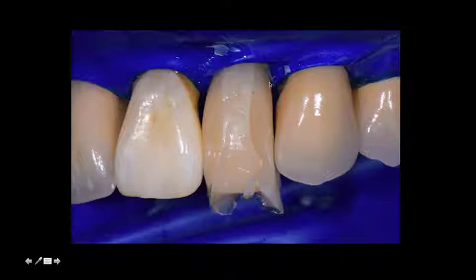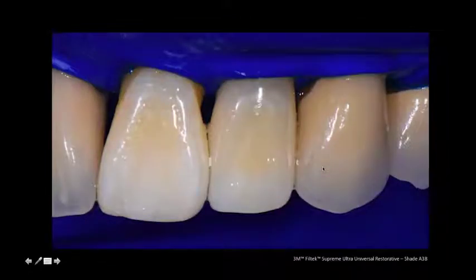So you can see that the value in this middle zone is quite a bit higher than this mylar zone, which is actually the true color of the composite. And then here you can see the finished restoration. Now, keep in mind that this tooth still has a 360-degree wrap of composite over the entire tooth.